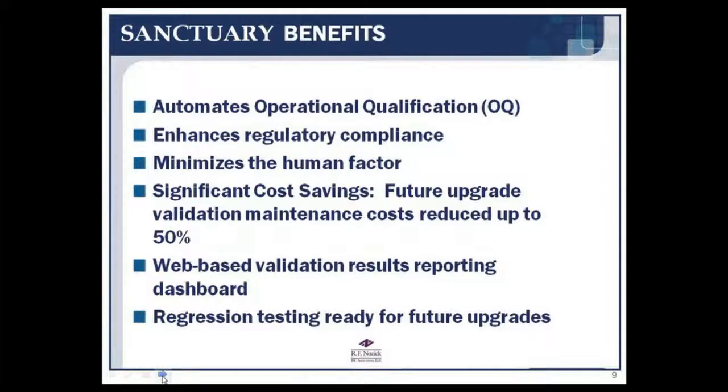What are the benefits of Sanctuary? The benefits are it automates the operational qualification process. This is the same operational qualification process that we've been using for the last 10 or 15 years, but we have now used automation to help save time and cost. It enhances regulatory requirements. And how does it do that?